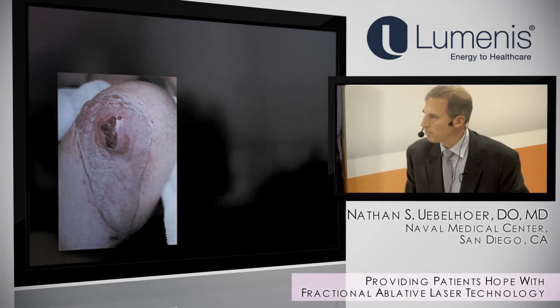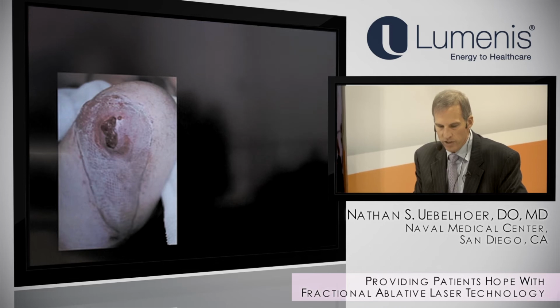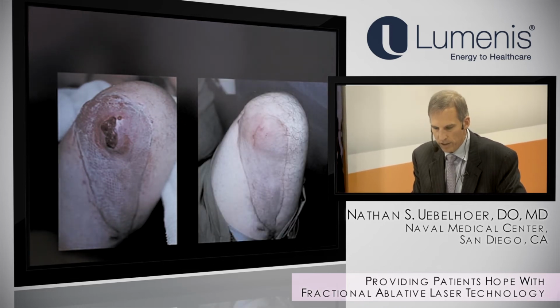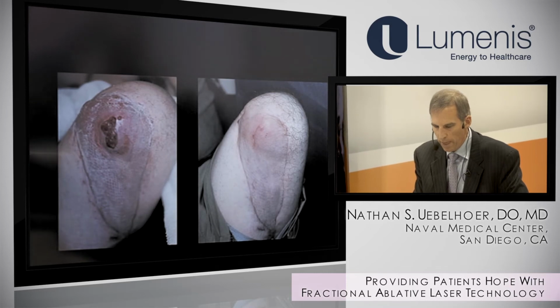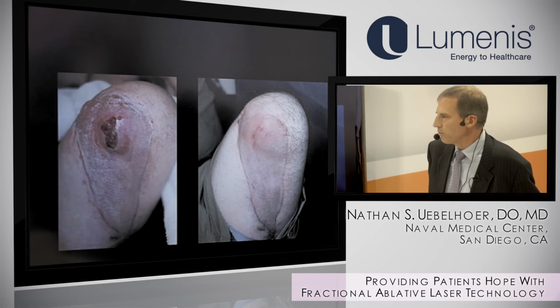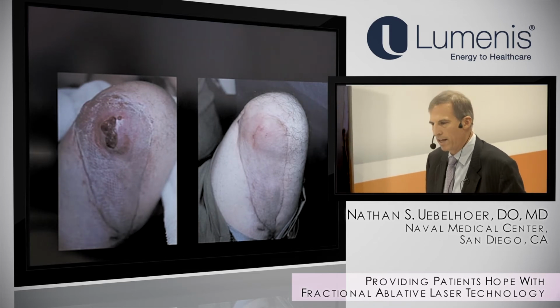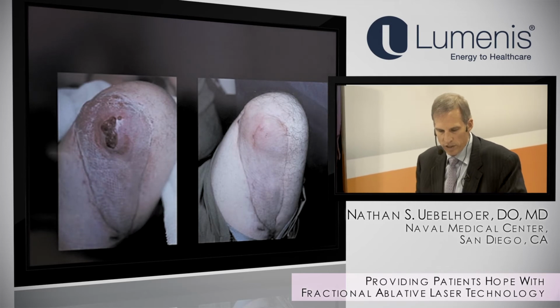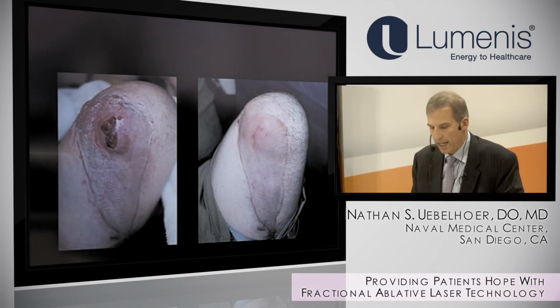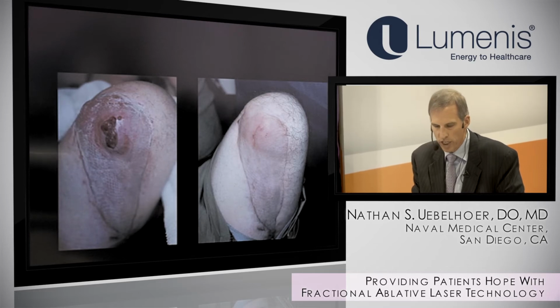Using, again, the same protocol of this high-energy, low-density fractional laser treating the scar and the wound bed. And you can see the improvement in this one as well. That makes a big difference for somebody who's walking on a leg on a prosthetic, where they can now use that prosthetic and be ambulatory for much more of the day, compared to when they have the ulcer and they have to keep taking it off and keep changing those dressings.